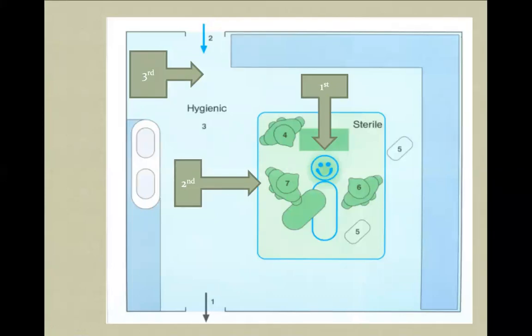But with dental implants, it's not so. With dental implants, you can stop here, for example, or here, and there are a number of dental implants with different diameters and different lengths. Once you expose the bone and use your drills, you create the drill holes for the dental implants.